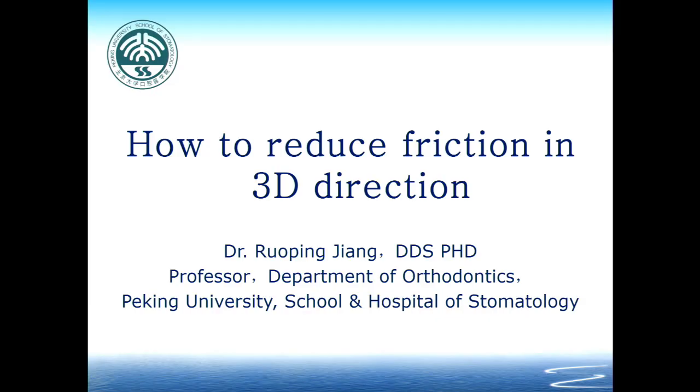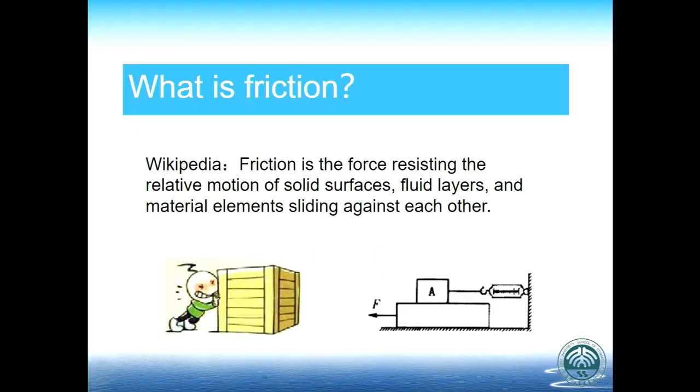Okay, so the topic is about how to reduce friction in 3D directions. So, what is friction? Friction is the force resisting the relative motion of solid surfaces, layers, and material elements sliding against each other, just like this.